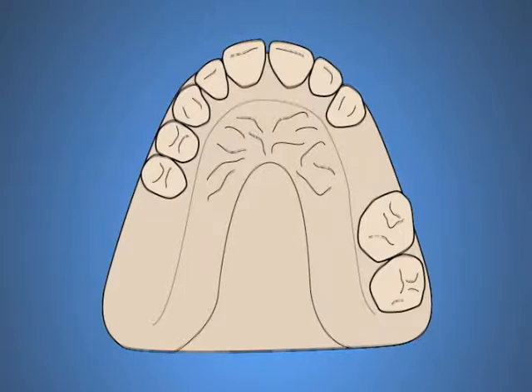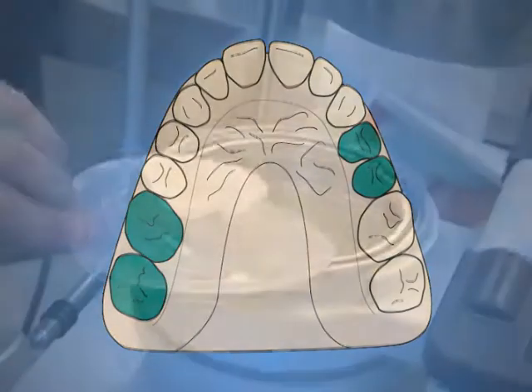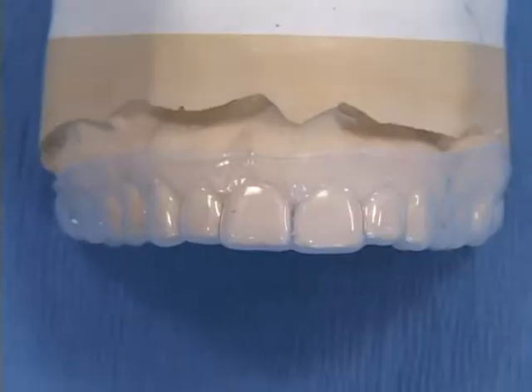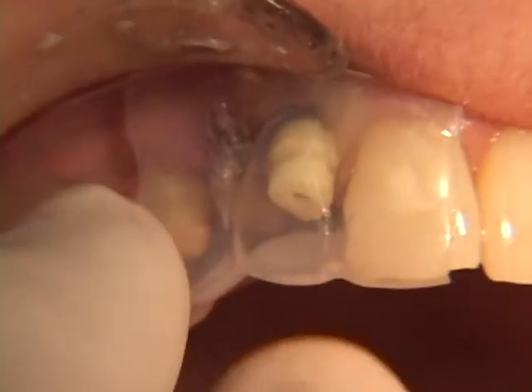After making an impression and a subsequent cast of the diagnostic wax-up of the intended restoration, a vacuum-formed template is formed onto the cast from thin template stock, which is used in restorative dentistry for the chairside fabrication of transitional restorations.